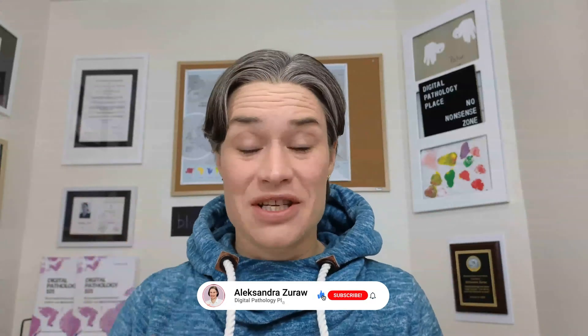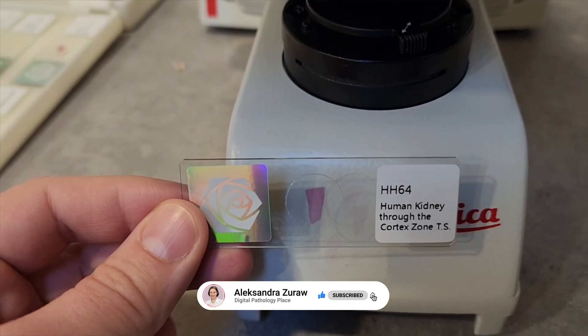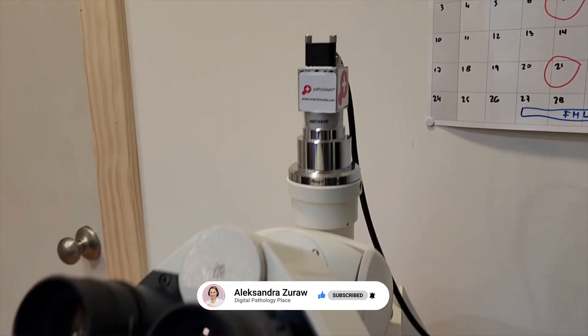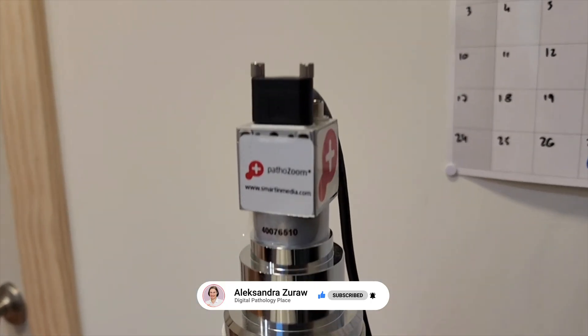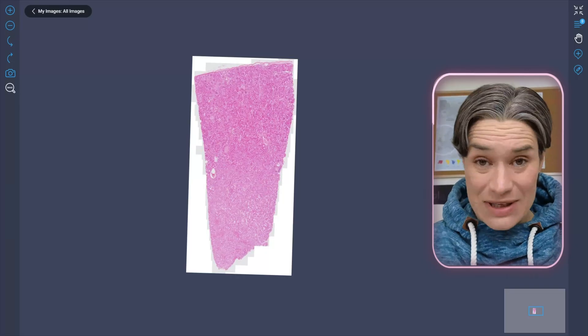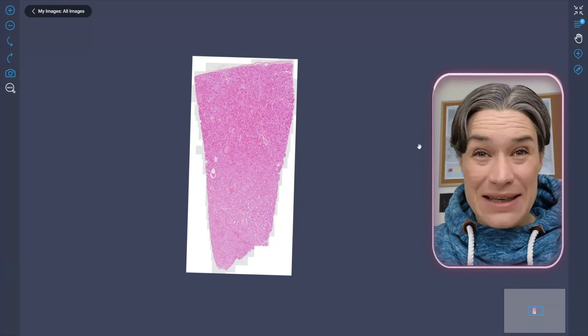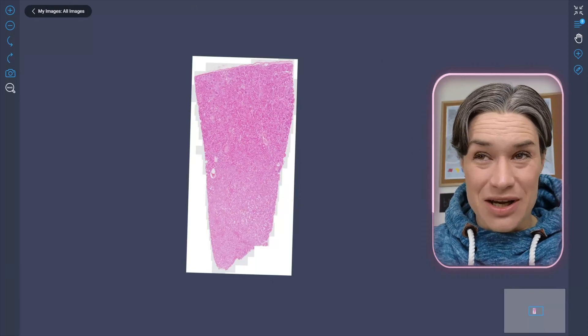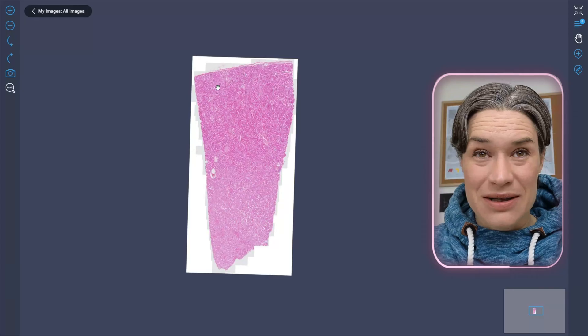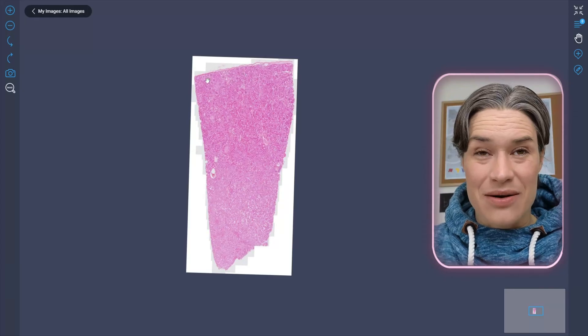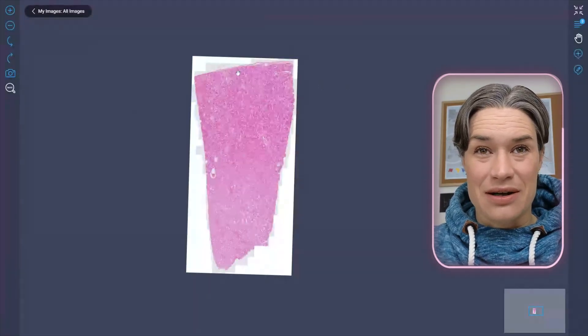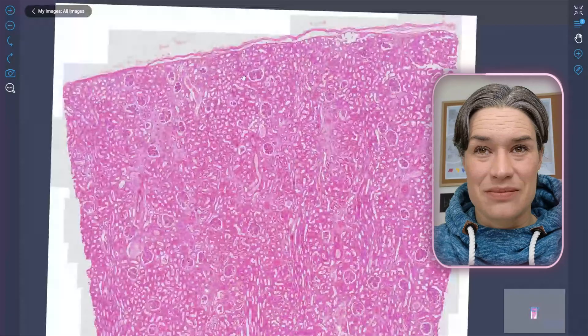There is only one structure in this tissue that you need to find to know it's kidney. I took this kidney slide and quickly scanned it with my tiny PathoZoom camera to show you this one structure and the rest of the kidney. The structure of interest is the glomerulus, or renal corpuscle, and it's even visible from this magnification. If you look here, these round structures are the glomeruli. So let me zoom in.